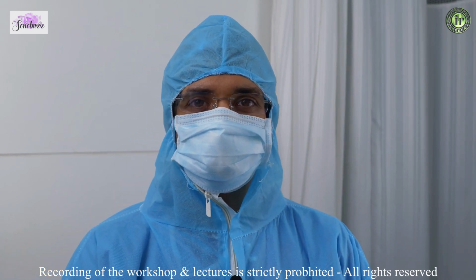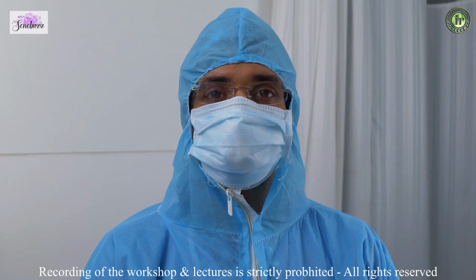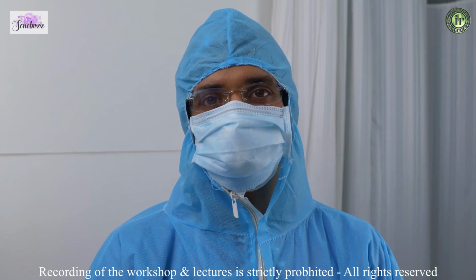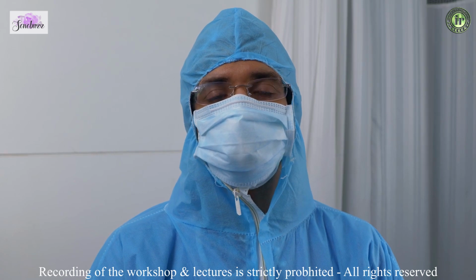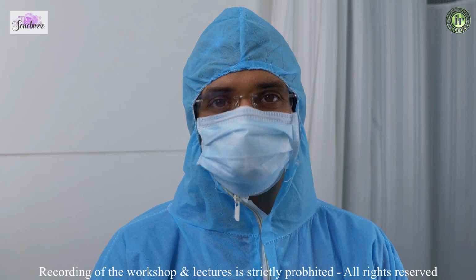And today I'm going to be discussing with you elastography. So I'm going to be talking on the techniques of doing liver elastography. And of course, at the end of it, we look at what are the new concepts that have come up whereby we can interpret our studies better.